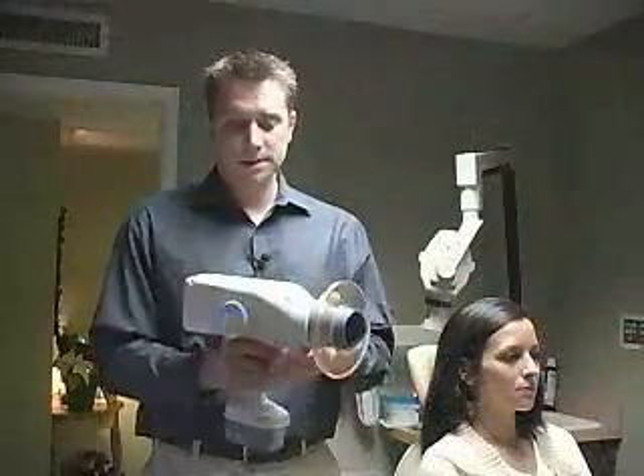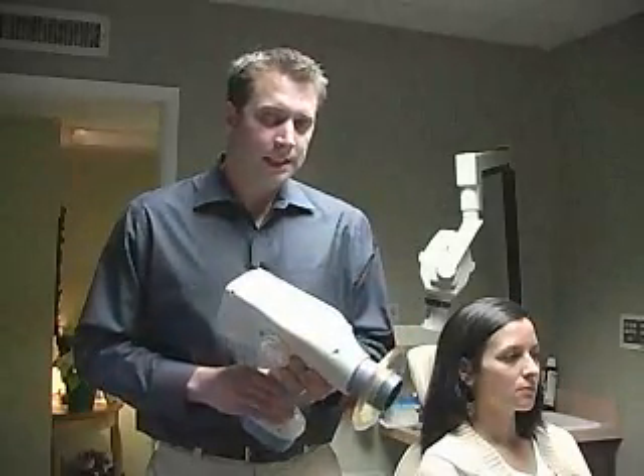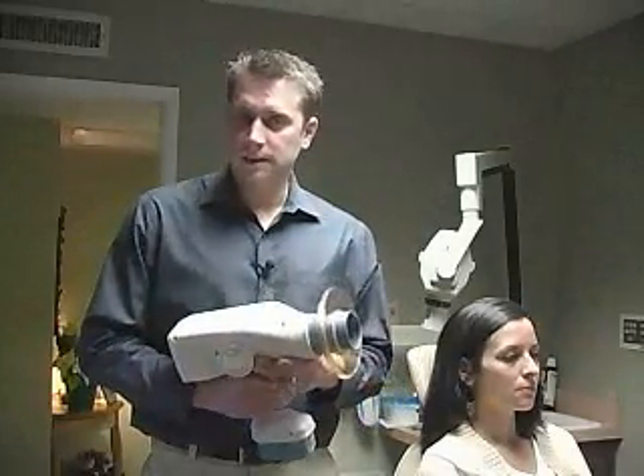Another exciting application for this is in hospital dentistry. You can bring this up to various floors of the hospital — you don't have to bring patients down to your clinic to get nice images. You can also use this in disaster recovery situations, third world countries, anywhere where access is difficult.